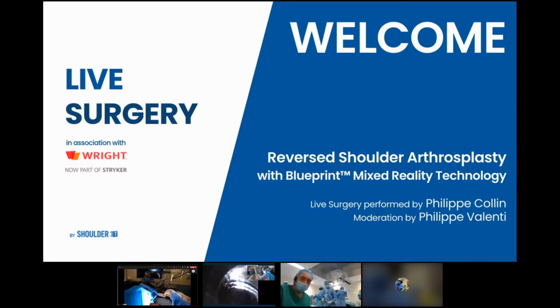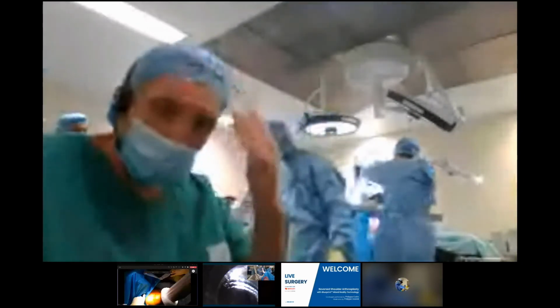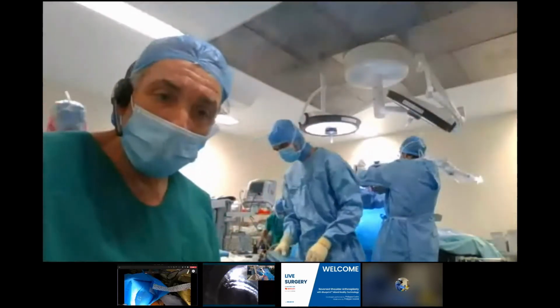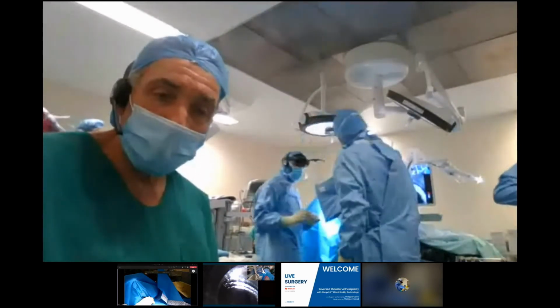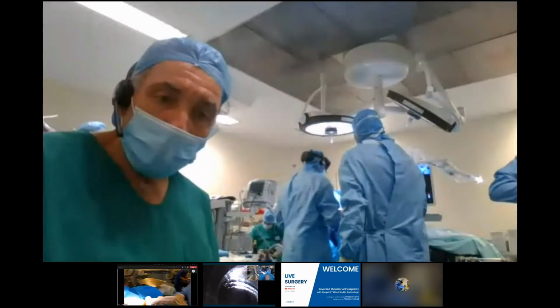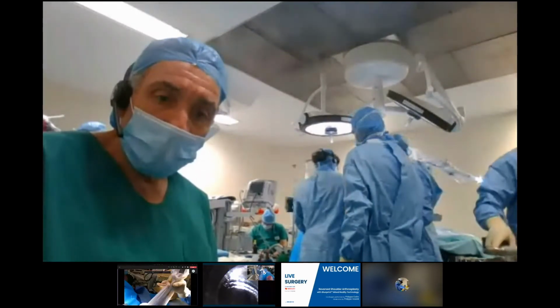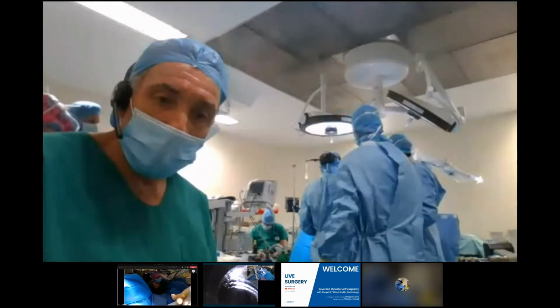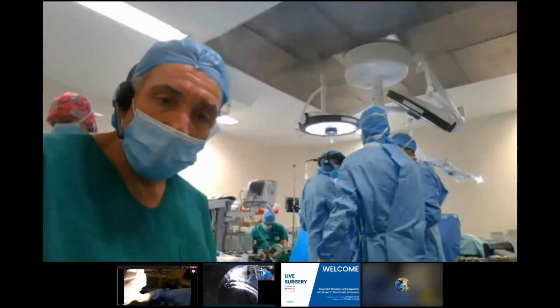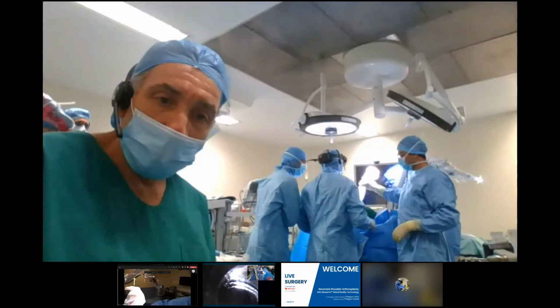Hello everyone. This is Dr. Valenti. I am very happy to receive my colleague and friend Philippe Collin, who will do shoulder arthroplasty, reverse arthroplasty. And the particularity is that he uses mixed reality, and he will explain how he will do.